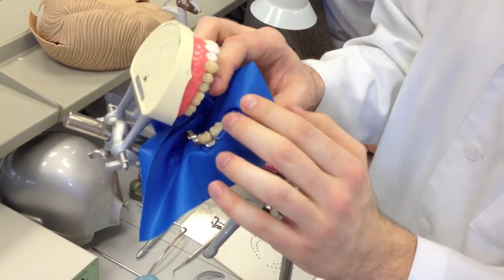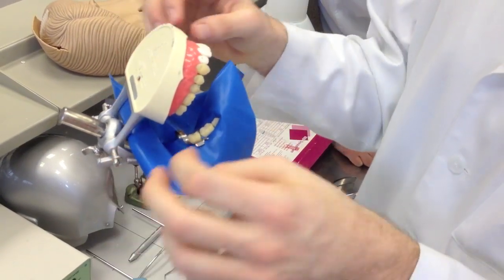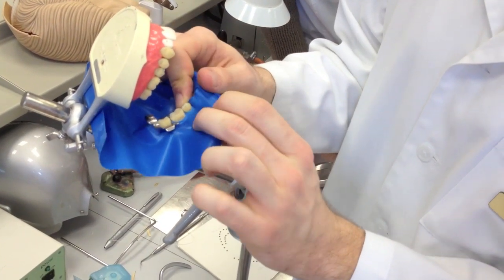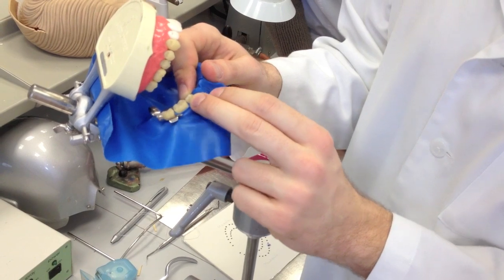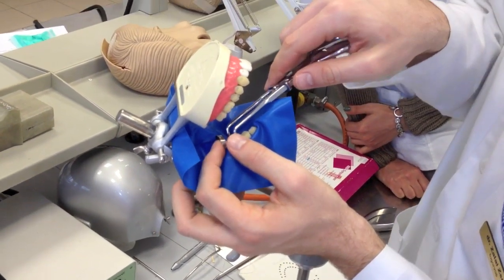Then the same way, apply it on the adjacent teeth. Check with the floss if it has passed the approximate contact point. If necessary, fix it with the wedge, and then you're done — of course, the frame and all the rest.